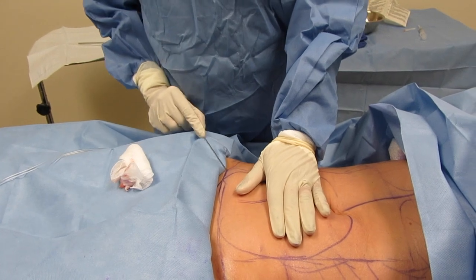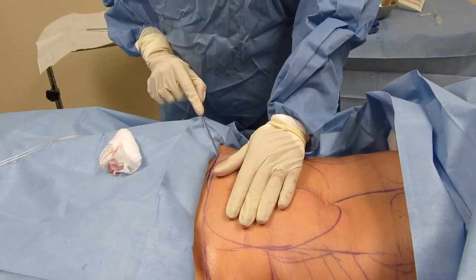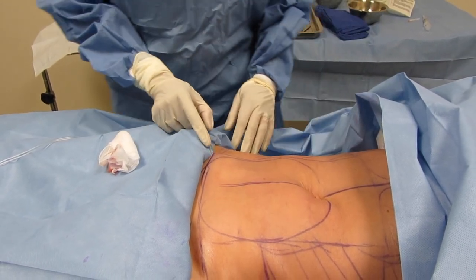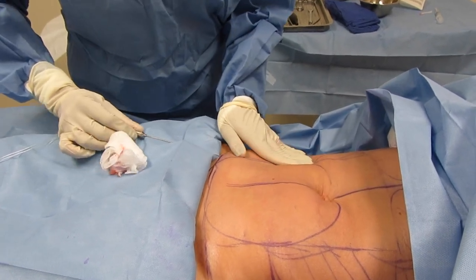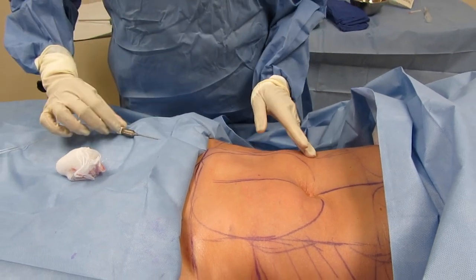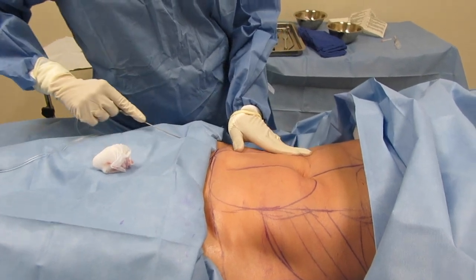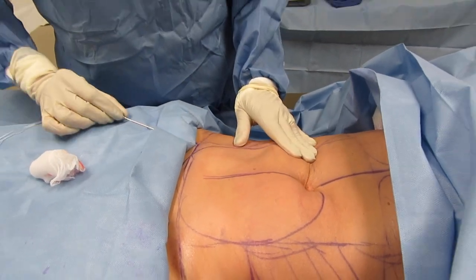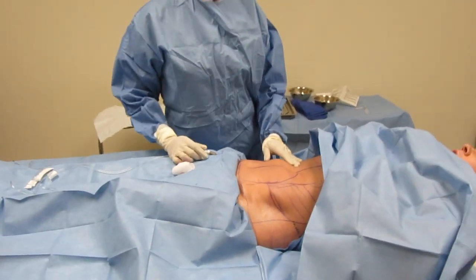So how are the fat cells broken up? Now this is, as I told you, the first step, where we numb you. The second stage or step is where I would take the ultrasound probe and the tip is where the ultrasound is emitted and it goes in and the fat cells are broken down just with the vibration of the sound.